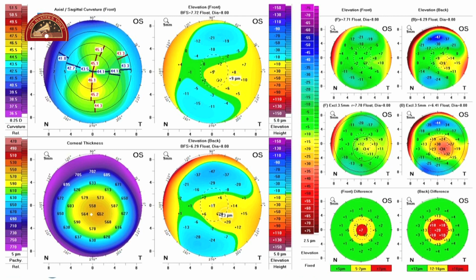Now we go to the next patient. Again, here we see a slightly steeper cornea, but very comparable thickness to the previous case. The Pentacam map shows that yes, something suspicious is there, because on the posterior surface you do see an example of a steeper elevation. And when we looked at the corneal diameter, it was 9.97 millimeters in this case, but the BAD-D suddenly increased to 2.98. And this, in the eyes of most corneal and refractive surgery specialists, can lead to wrong interpretations of which cornea is truly healthy and which cornea is actually suspicious.